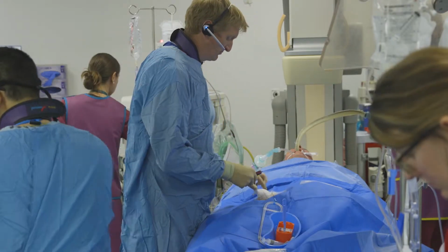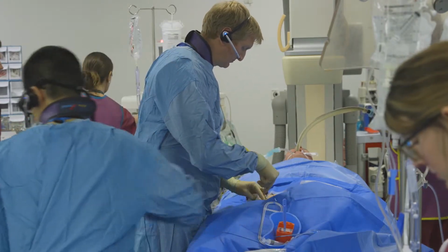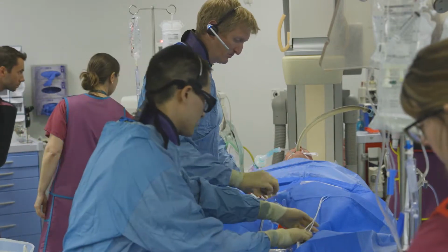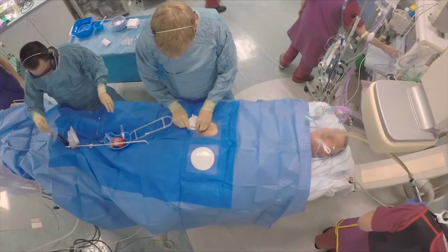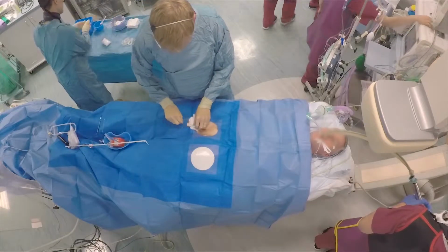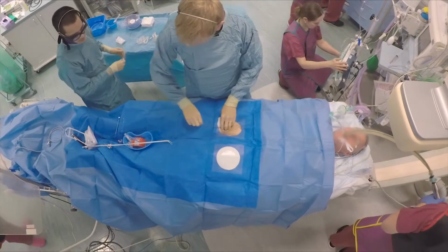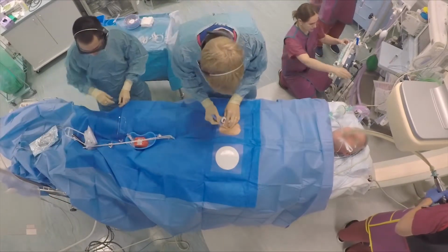If it takes more, I'm aware that the case is probably more difficult, and at that point my mindset and how I approach the case alters, and I take myself out of the standardised process and realise what is different. Here, this is going to be a standardised case with no complications in terms of difficulty.